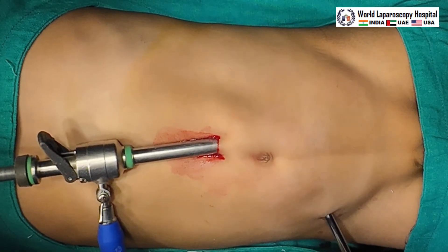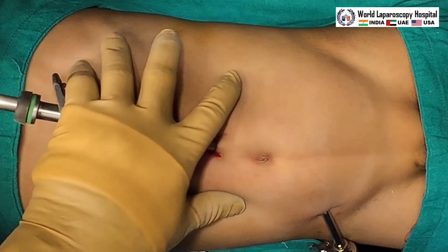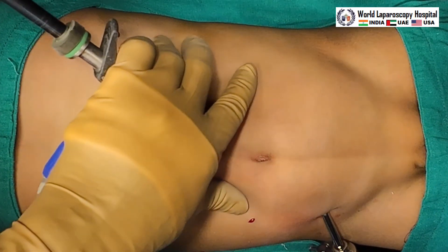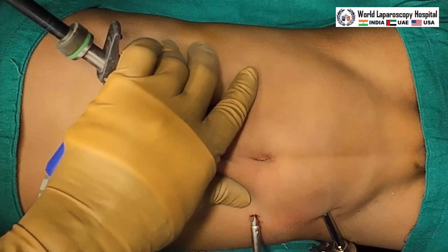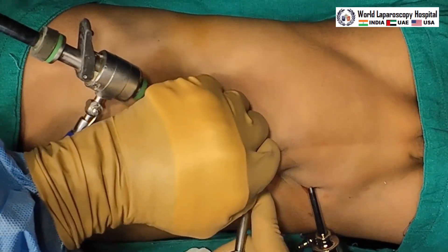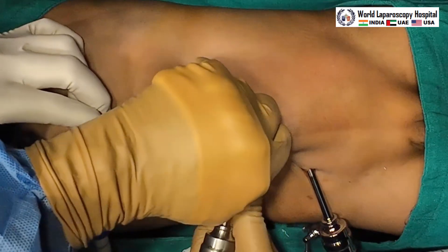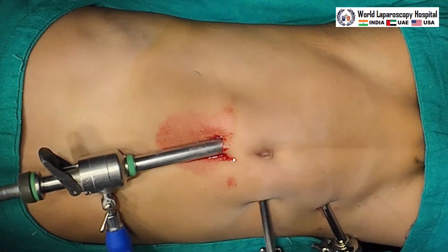The third port will be placed at the level of the umbilicus and this third port is now introduced. All ports are introduced and we will start the surgery.